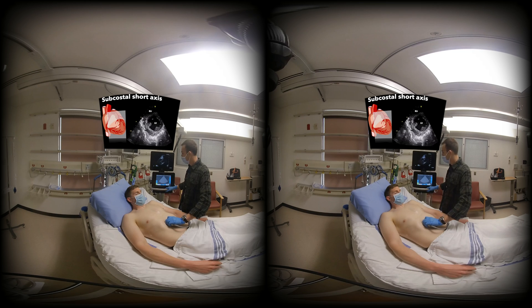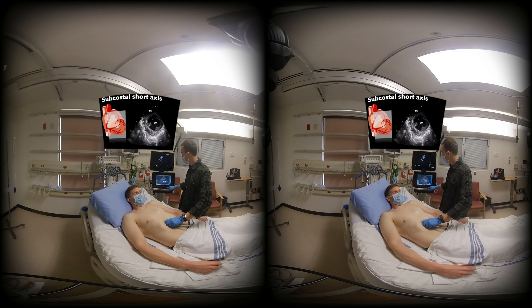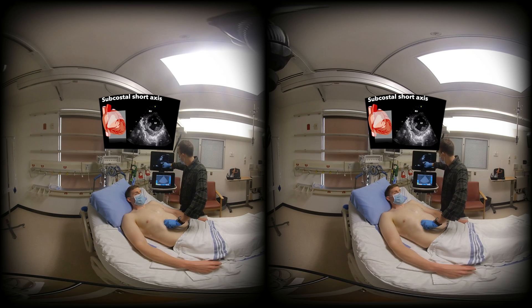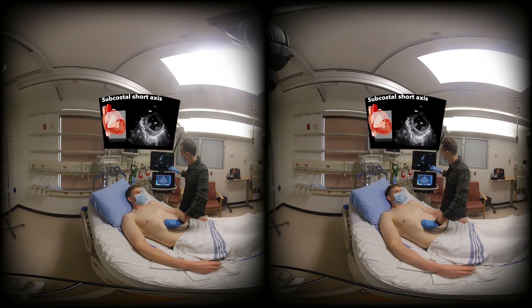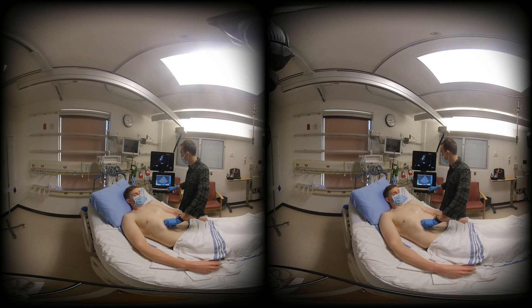It's sometimes possible to achieve a short axis view from this window when it's not possible parasternally. To do that, I rotate the transducer 90 degrees so that the probe marker is facing completely upwards and then angulate towards the patient's left shoulder. This gives a similar donut-shaped appearance of the LV with the RV on top of the screen — a useful way to assess biventricular function when parasternal views aren't available.